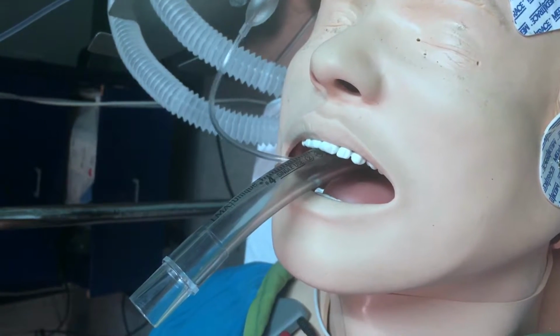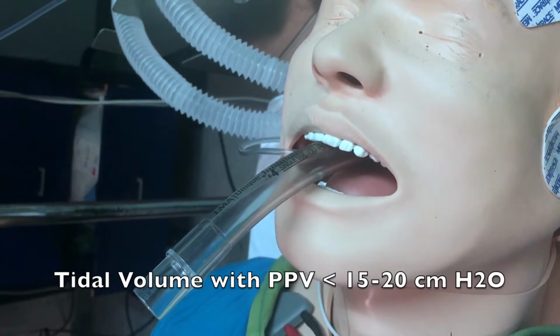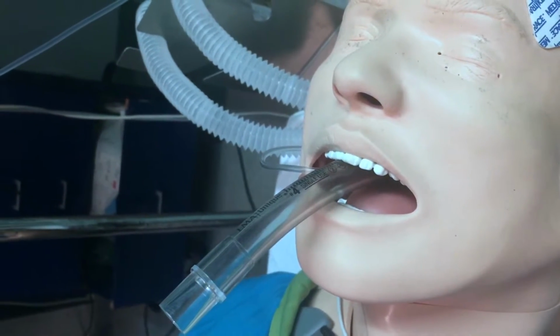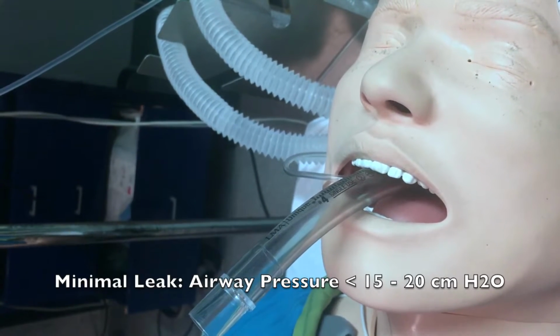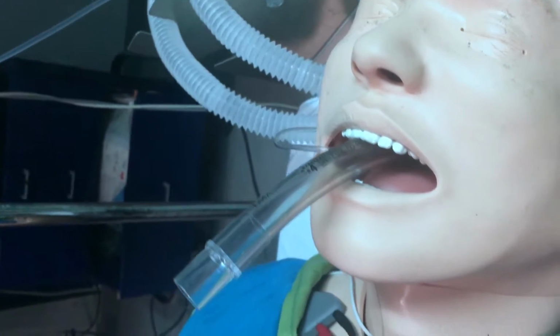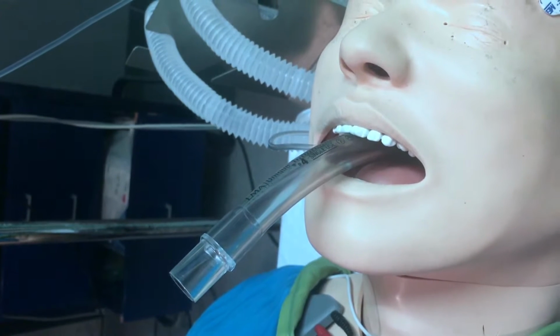ventilation, you see if there's adequate tidal volume for the patient's weight with positive pressure ventilation less than 15 to 20 centimeters of water. Another way is to see if there's a minimal leak with airway pressure less than 15 to 20 centimeters of water. You can assess that by auscultating over the trachea over here. So those are the ways in which you put in an LMA.